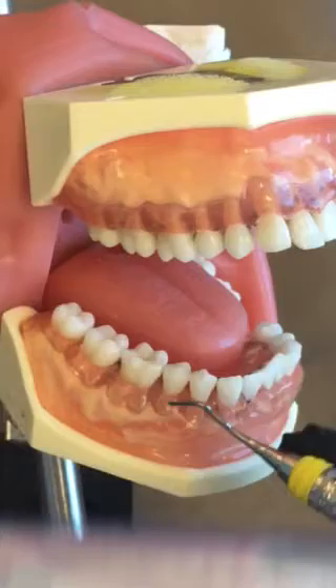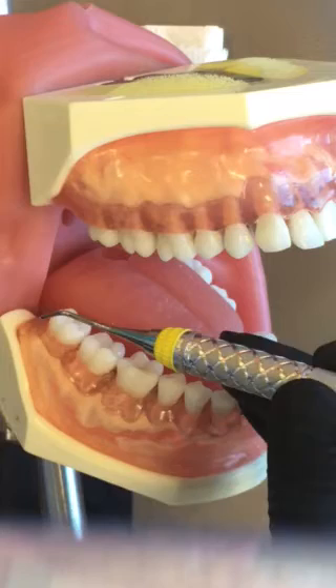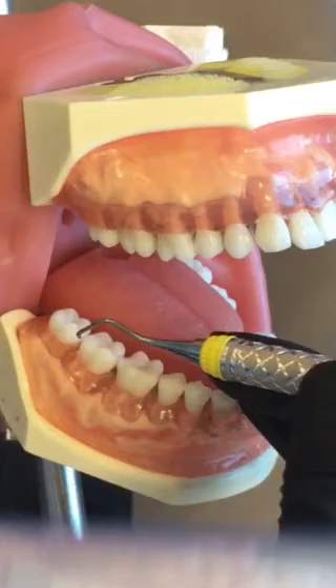This is your 4R4L Universal Curette. It's used posterior only and is good for larger deposits and deeper pocket areas, or for reach in hard-to-reach areas in the posterior. It does have a longer shank than the 13-14, but the design is pretty much identical other than that.